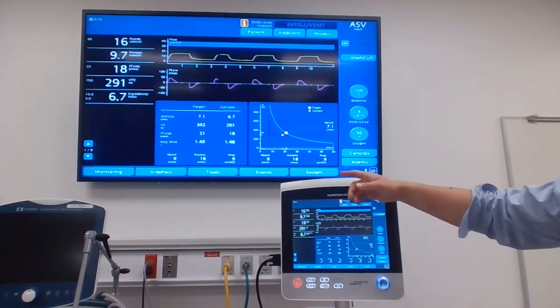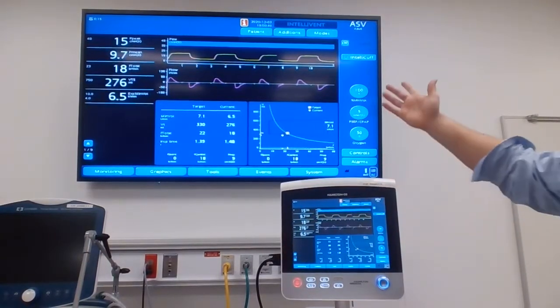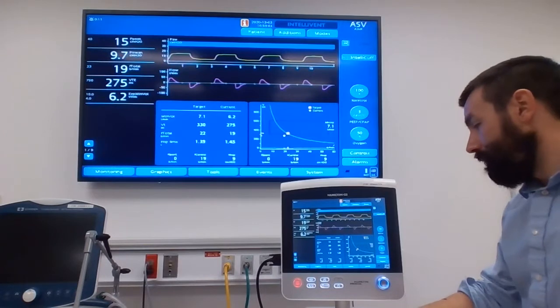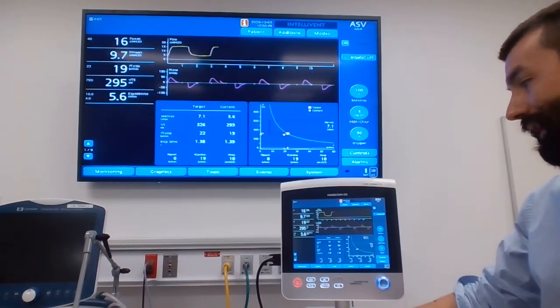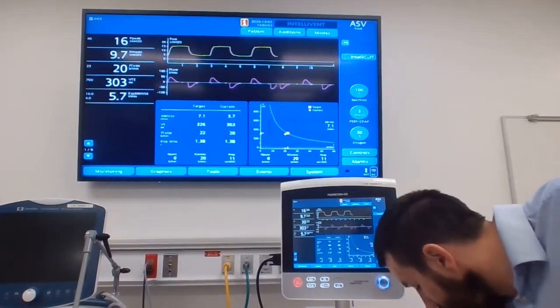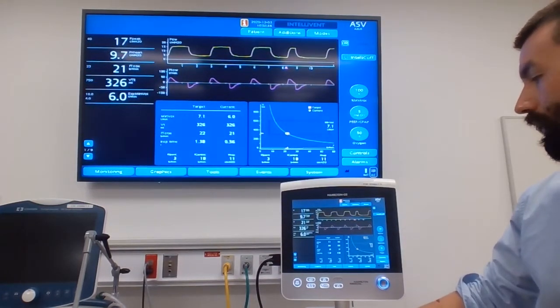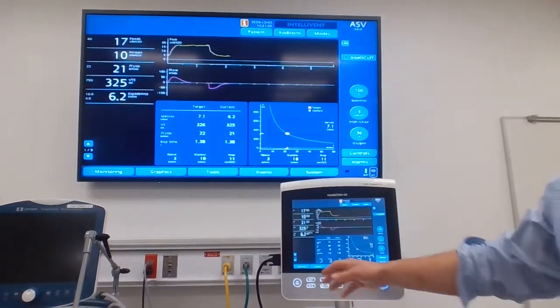So if you look, just to prove my points here, if you look at your pressure waveform, it's square, so we know that this is a pressure delivered breath. So why is this important? I like to access these just to show you. And it looks like I got maybe a little leak on my flow trigger here. Hang on a second. Or my flow sensor, I mean.